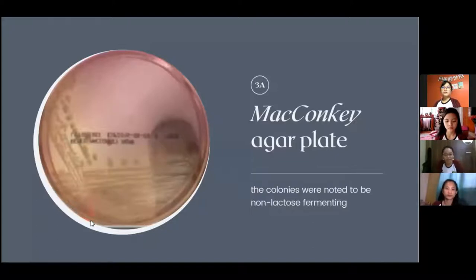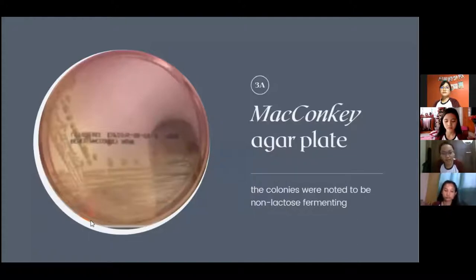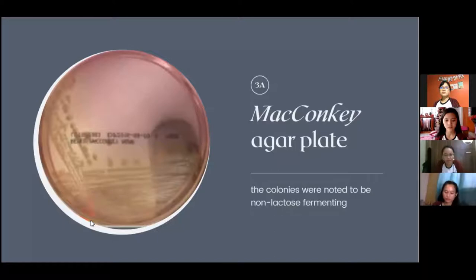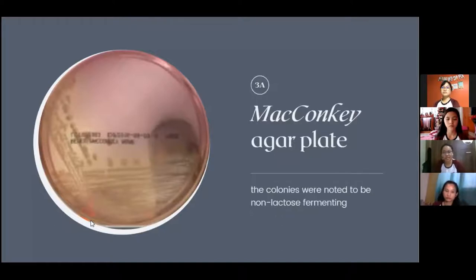The MacConkey agar plate is used to differentiate lactose fermenter organisms from non-lactose fermenter organisms. In this case, the colonies were noted to be non-lactose fermenting — colorless — because it is a non-lactose fermenter.